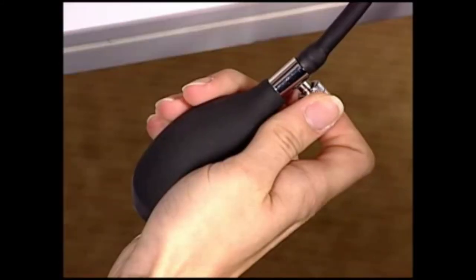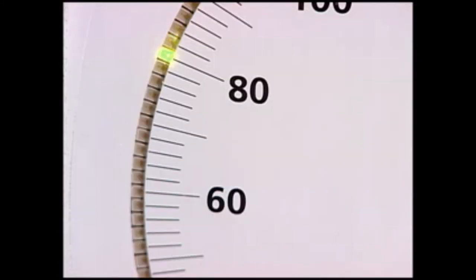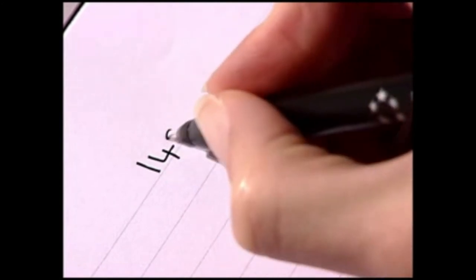Continue deflating the cuff and note the diastolic blood pressure when the repetitive sounds disappear. Make one careful measurement of the systolic and diastolic pressures. Repeat the measurement if necessary, leaving a short break between measurements.